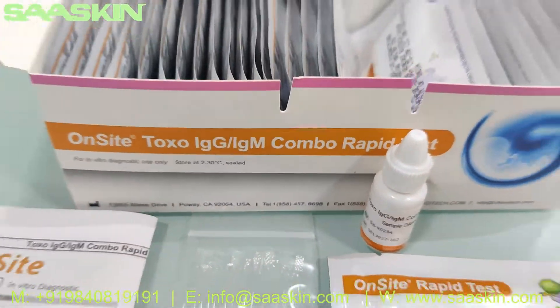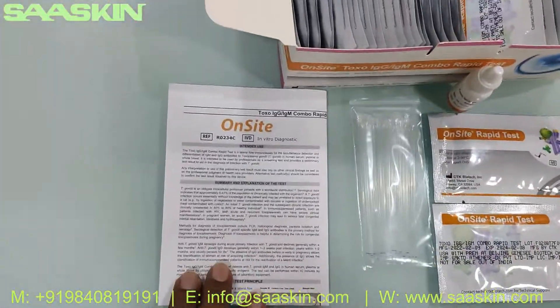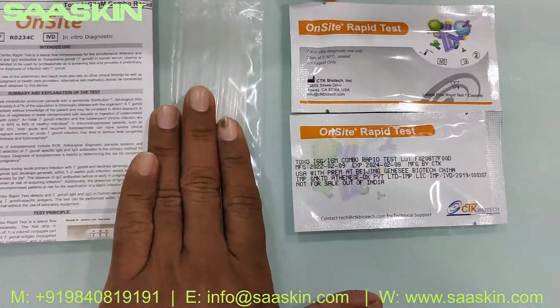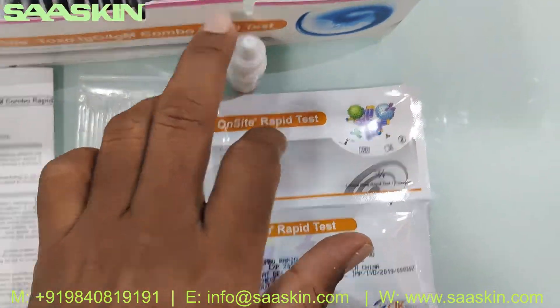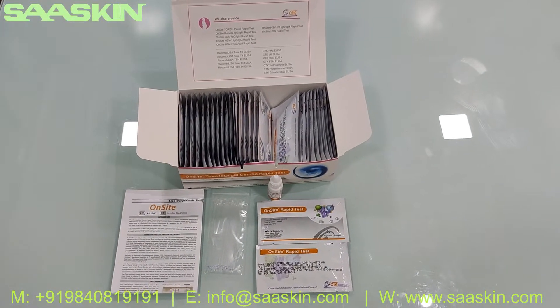A quick summary: this is the CTK Biotech On-Site Toxo IgG IgM Combo Rabbit Test kit. Inside the 30-test kit box you have one IFU brochure, 30 capillary tubes, one buffer bottle, and 30 test cassettes. This is how the total test kit box looks like — thank you.